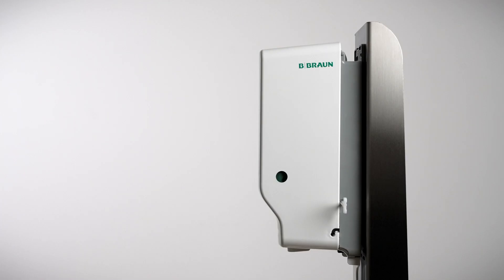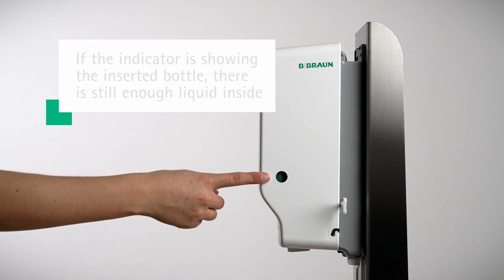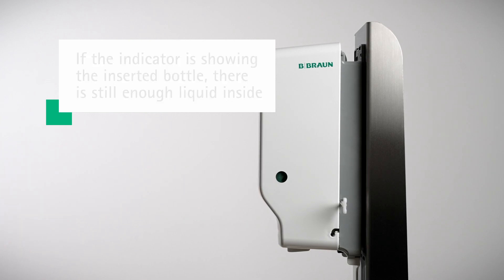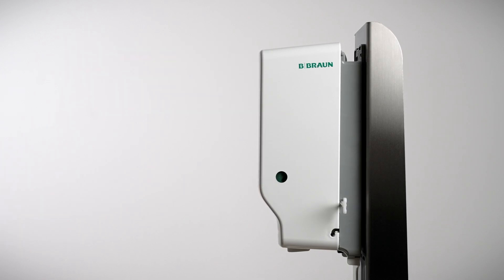On both sides of the automatic dispenser, you will see the bottle change indicator. This bottle change indicator works only when the bottle is inserted correctly, as explained in the previous step. If the indicator is green, there is still enough liquid in the bottle. If it turns partially orange, the filling level is decreasing. An orange filling level shows you the bottle is empty and you need to replace it.